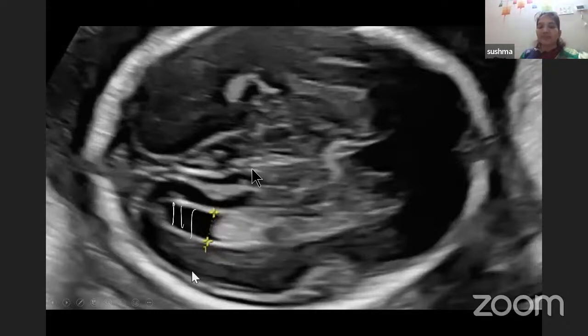So the placement of the cursor here is also very important. Where is the cursor to be placed? If you take the ventricular wall here, the cursor placement should be on the wall, on-to-on measurement. This is the horizontal crossbar and this is the vertical crossbar. And here also, this is the horizontal crossbar and this is the vertical crossbar. So that is how we have to place the crossbar. This is according to ISUOG guidelines.